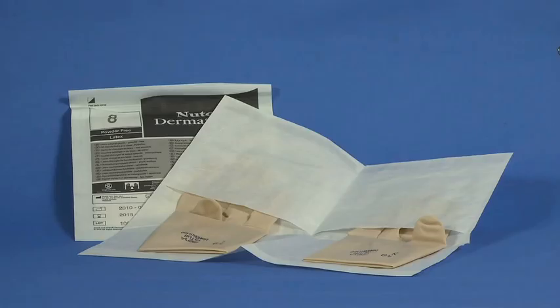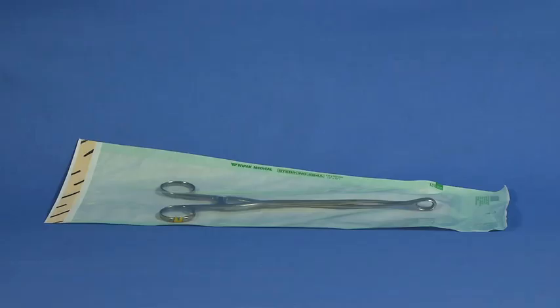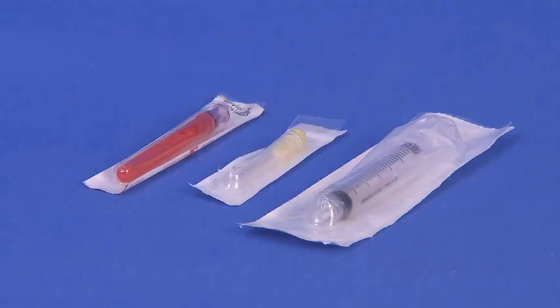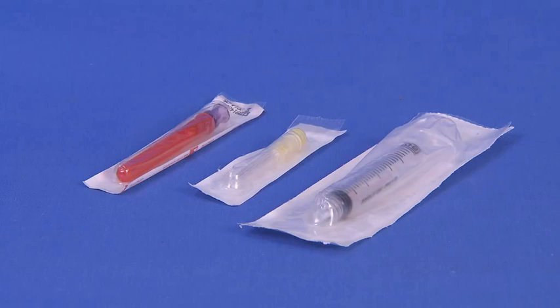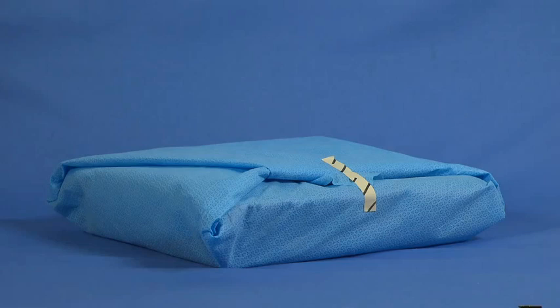Sterile gloves, sterile drapes, sterile transfer forceps if necessary, a minor surgery tray or instrument stand, equipment to administer anesthetics such as needles, syringes, and a vial of anesthetic, a sterile surgery instrument pack as requested by the physician.